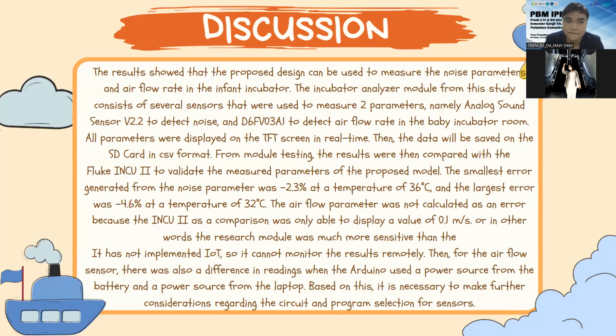Okay, my next presentation is about the discussion. The result showed that the proposed design can be used to measure the noise parameter and airflow rate in an infant incubator. The incubator analyzer module from this study consists of several sensors used to measure two parameters, namely the analog sound sensor V2.2 to detect noise, and the D6F-V03A1 to detect airflow rate in the baby incubator room. All parameters were displayed on the TFT screen in real time. Then the data is saved on an SD card in CSV format.